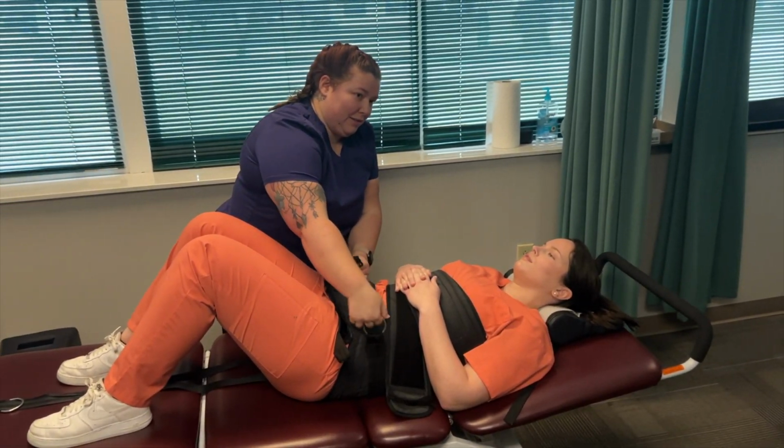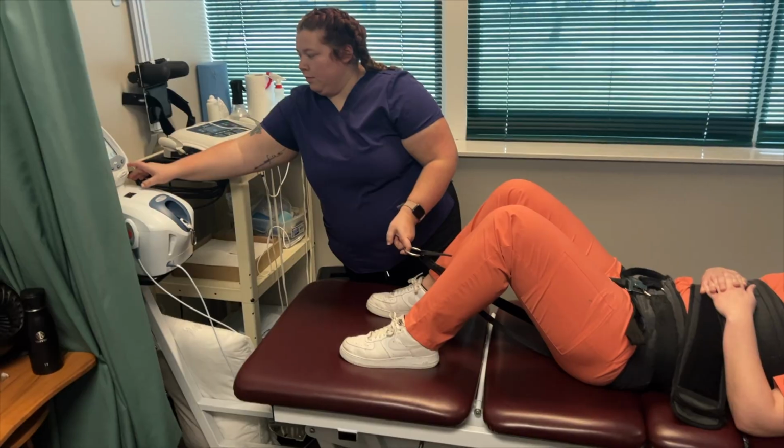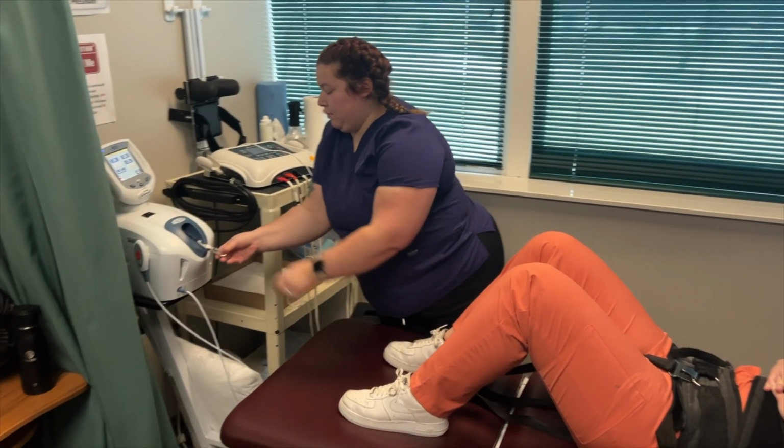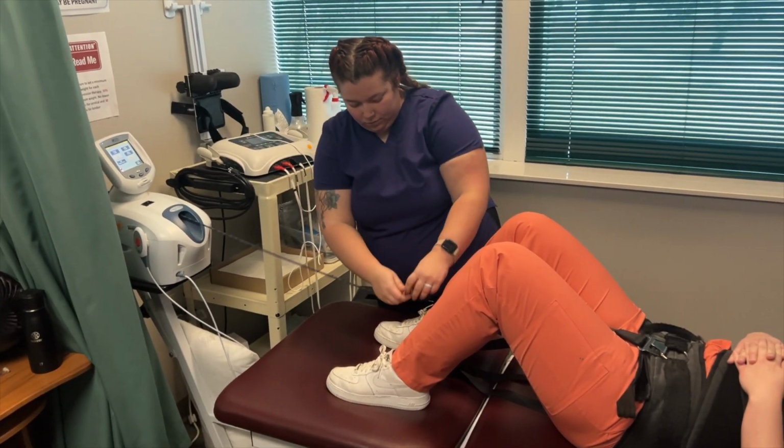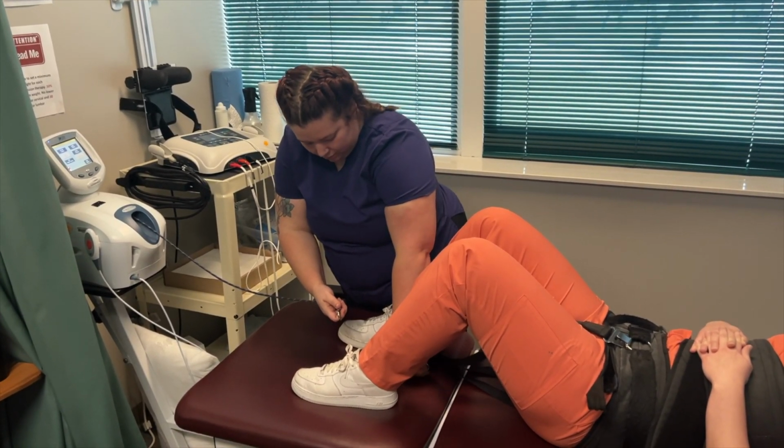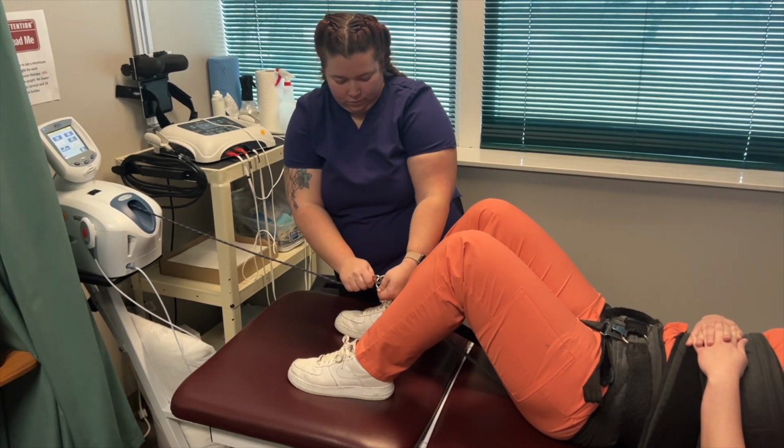What about those that say they've tried an inversion table or that sort of thing, and they really question whether this is an effective treatment? That's a good question. We get asked a lot about inversion tables or teeter-totters, the different brands that are out there. The inversion tables use your body weight as a mechanism to axial distract the spine, and it's a good at-home use. Does it work as well as the clinical versions? It does not. It's a good adjunct therapy, but it doesn't take the place of it.